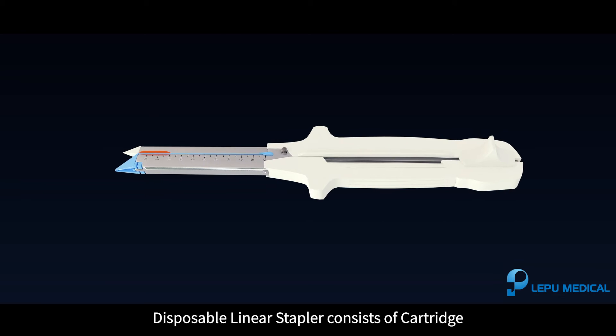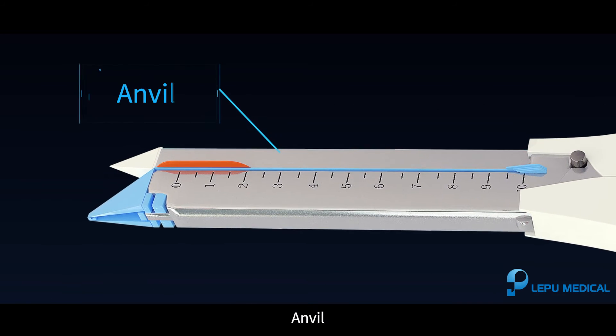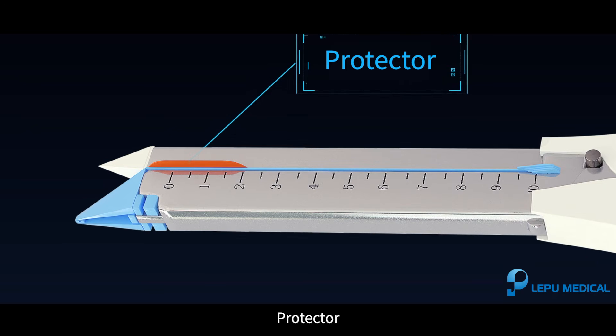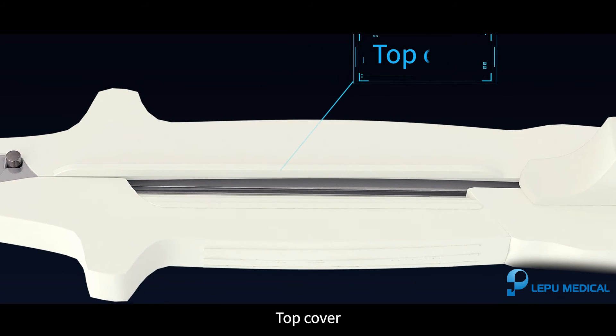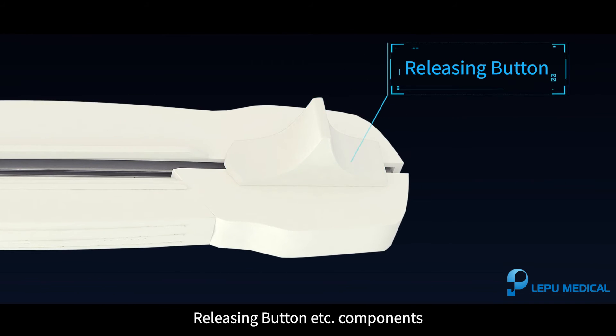The disposable linear stapler consists of the following components: cartridge, anvil, protector, top cover, bottom cover, and releasing button.